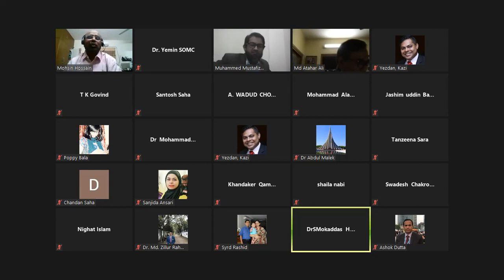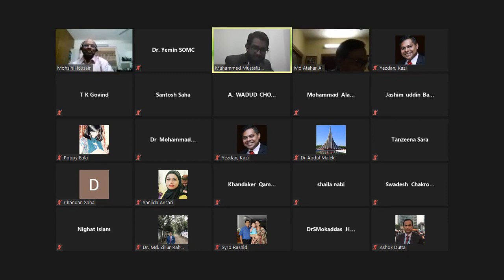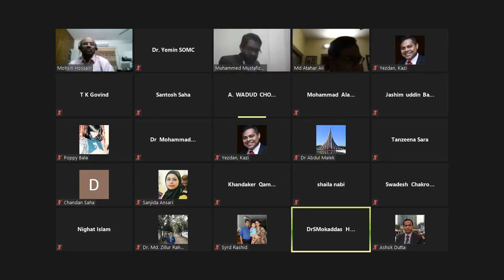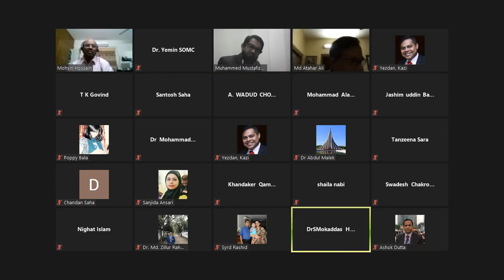Yeah, and I can talk on this issue. Can you help? Yeah, sure, sir. Yes, sir. Share your comment, sir. Comment: the PMT has an antegrade and a retrograde pathway. In the retrograde pathway, it involves the AV node. So drugs which block the AV node may be helpful, like beta blocker, verapamil, adenosine. And that's why I was asking. Carotid massage may help. Carotid massage, magnet should be tried first. Drug may be helpful, may not be helpful, but drug may be used.